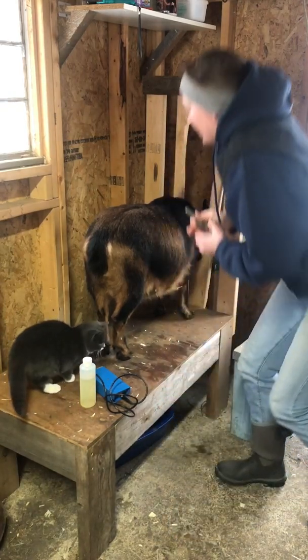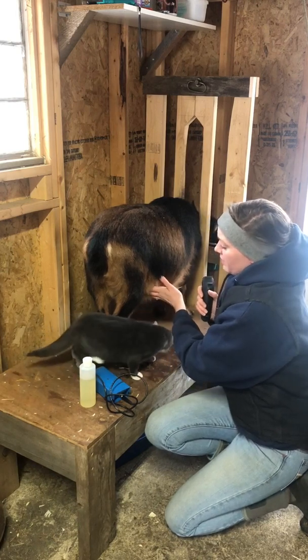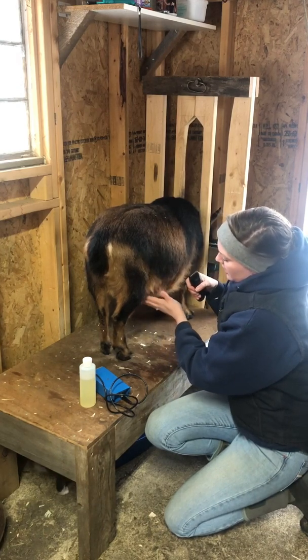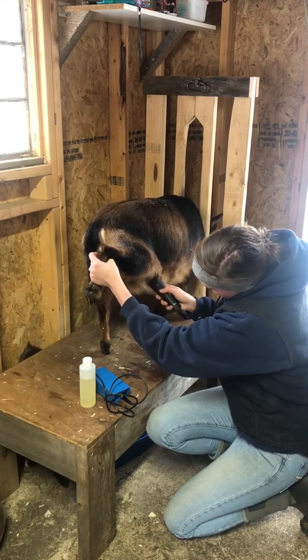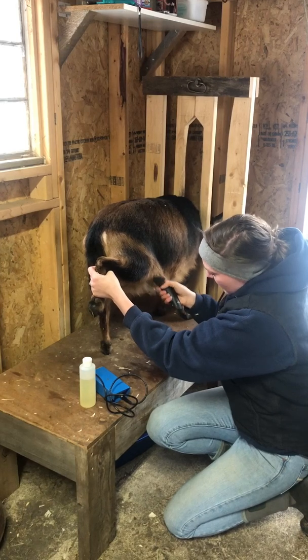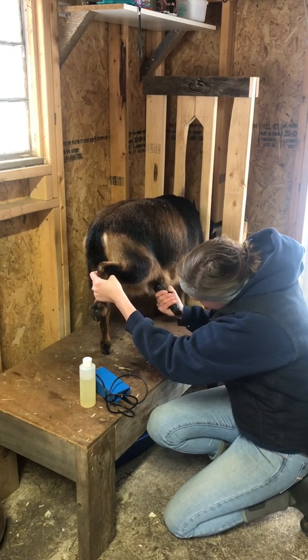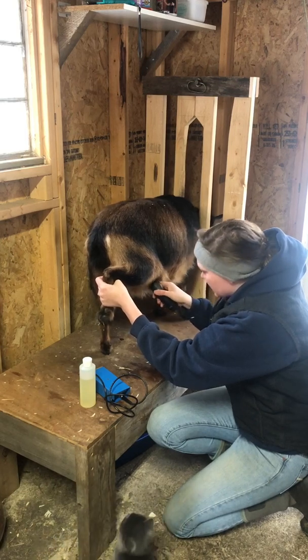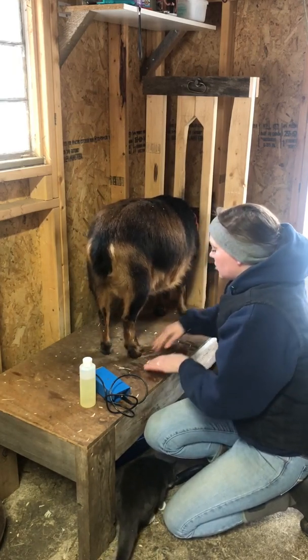I have her eating on the stand. The first thing I need to do with her — that I did not have to do with Big Marie — is shave a spot. You want to go right in front of their back leg, essentially in front of their udder. I've found the best spot is really almost under her leg and up — it's kind of on her side but also tucked under her leg. I just shave a fairly large spot because when you're testing early, that fluid is really difficult to detect, and it's nice to have a lot of space to move your probe around.